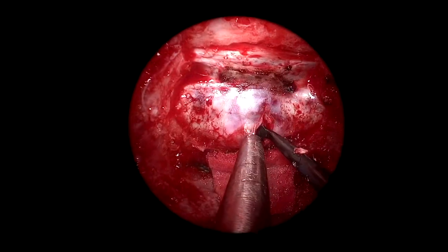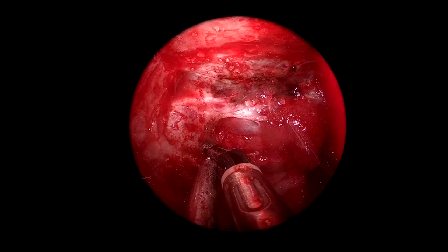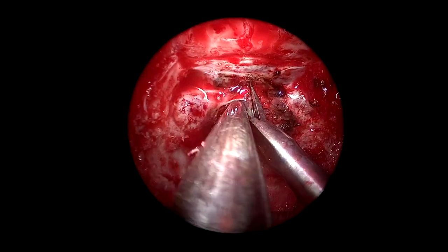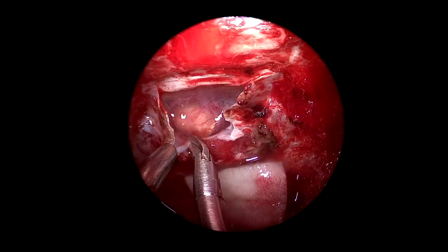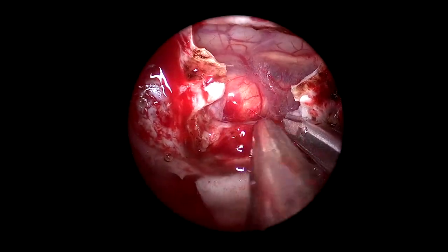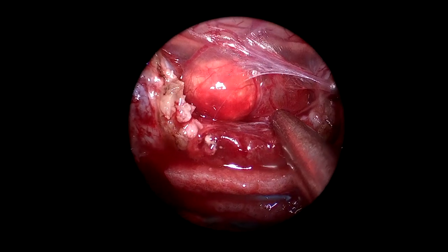We can see the limbus of the sphenoid. We uncover the dura along the tuberculum and start opening the two layers covering the pituitary gland, opening toward the cavernous sinus wall on each side and toward the clinoidal carotid artery on each side to maximize exposure of the pituitary gland. We cut the dura across the tuberculum sellae and superior intercavernous sinus, with an oblique cut toward the limbus of the sphenoid on each side to maximize exposure of the suprasellar space. The dura is folded toward the distal dural ring on each side, and the diaphragma sellae is cut, allowing early visualization of the carotid artery supraclinoid space.